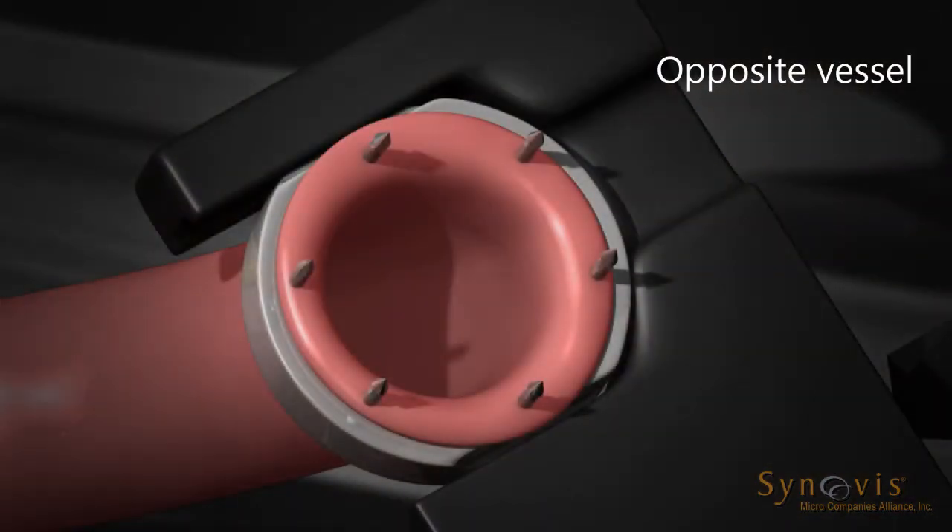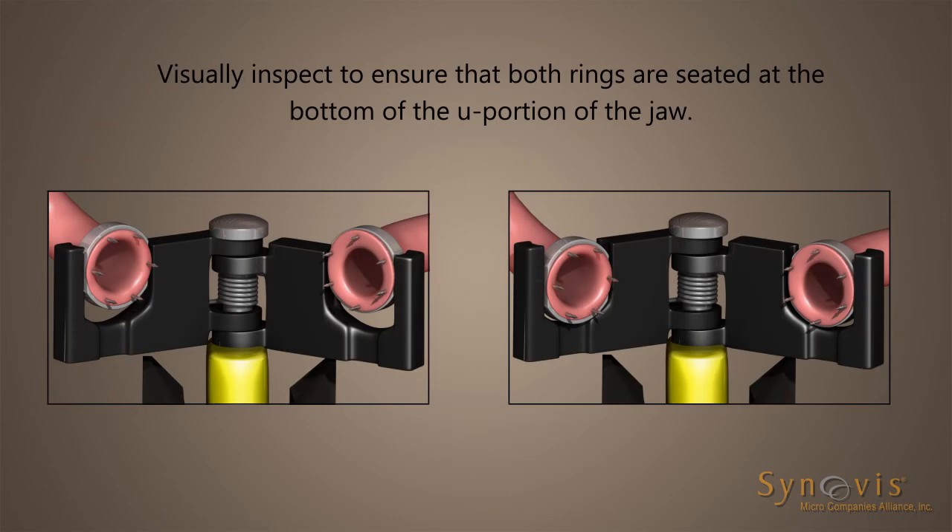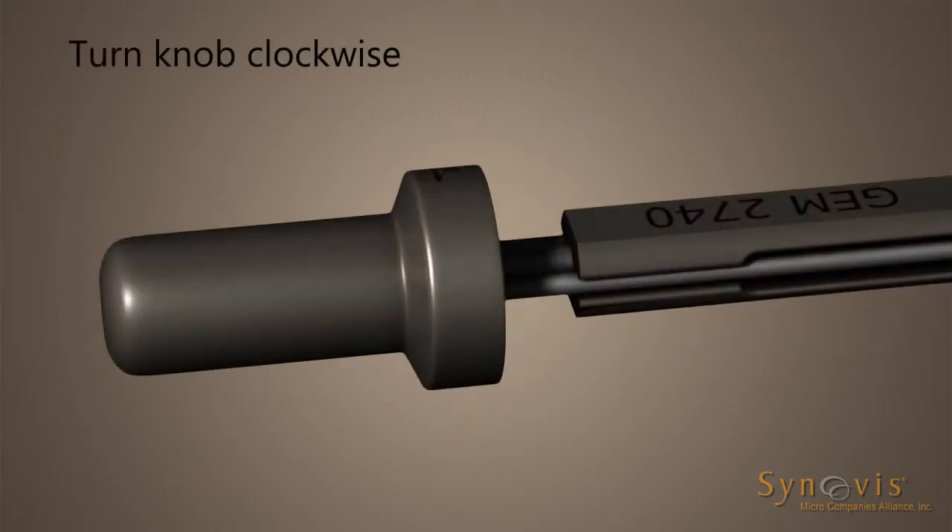Repeat steps to impale the other vessel end on the second coupler ring. When both vessel ends have been suitably impaled, visually inspect to ensure that both rings are seated at the bottom of the U portion of the jaw.